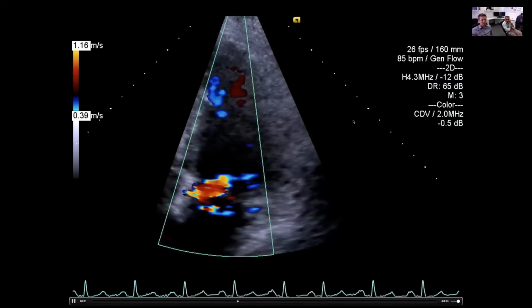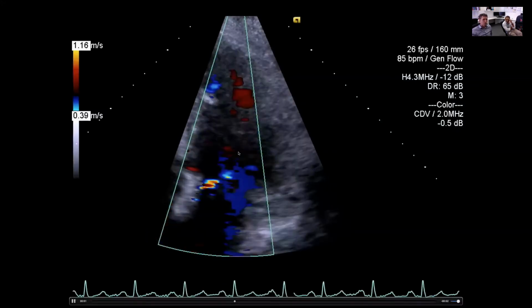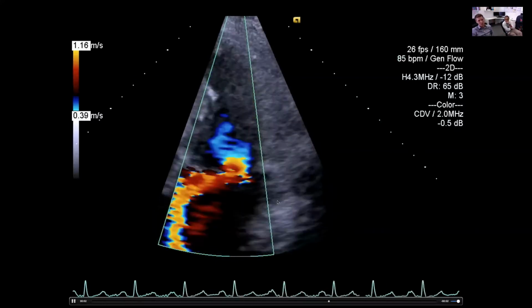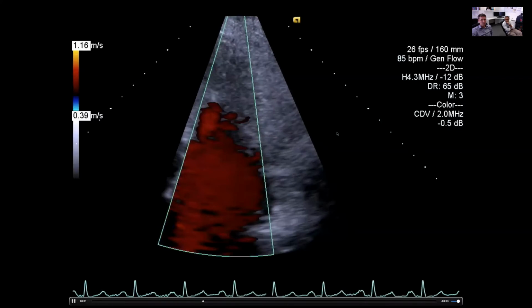So I tried to do, would you do vena contracta on that as well? Absolutely, you could do a vena contracta on that, but I think with both of them, I should be zooming in. Yes. So what I'm interested in is filling the screen, and we get the best temporal resolution. So I think I want to truly pause that up.